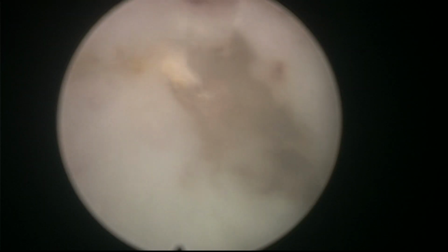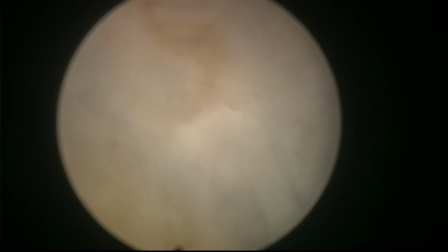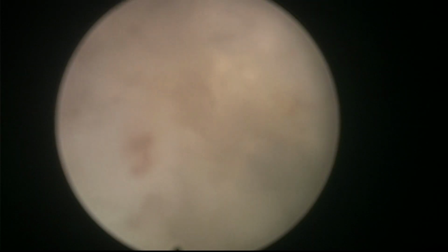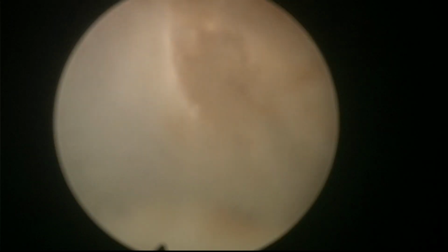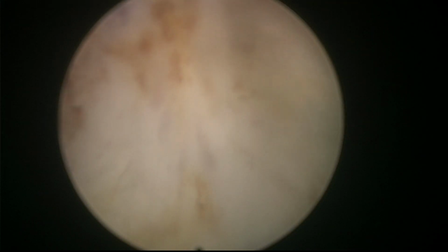Doing that dissection is not putting a lot of stress in the sphincter anteriorly here, so it's difficult to break it here. Now, of course, when we want to do the anterior part, we have to be careful and we have to detach here. When you go up and you reach near 12 o'clock, you have to cut a little bit more horizontally for some millimeters until you can enter here, progress anteriorly a little bit, and then of course you have to follow the direction of the fibers of the capsule to go anteriorly as much as you can.